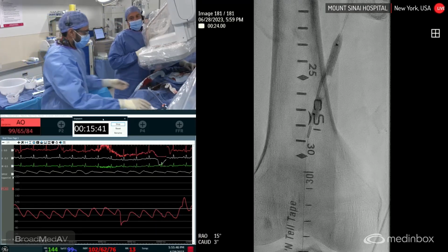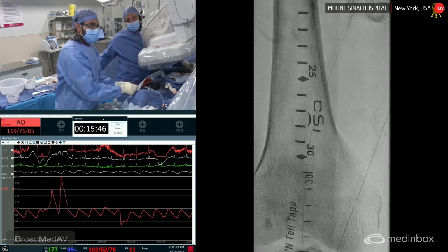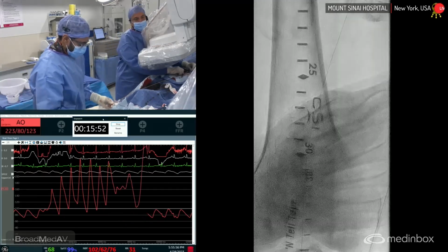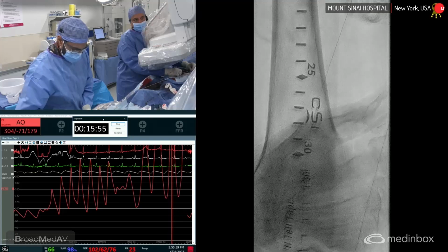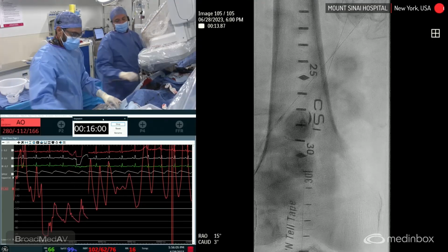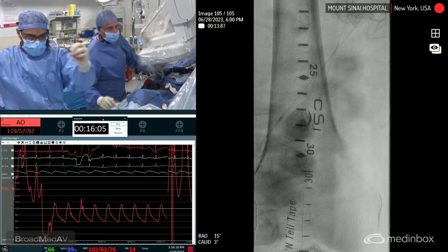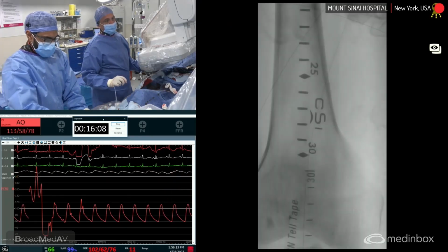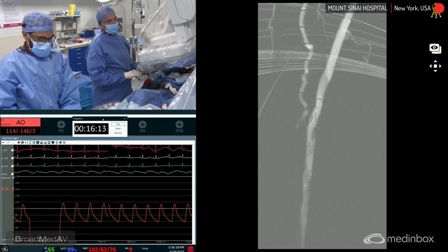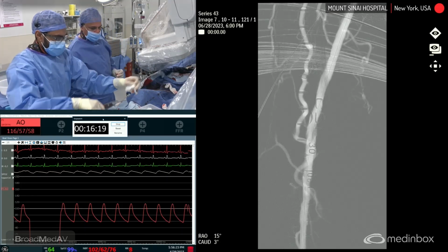Get the Supera ready, please. Yes, sir. And a 5.56. That's fine. Can I take a picture first? So again, we prepped the vessel for Supera. Let's go ahead and do a quick roadmap, like you said. So flush the Supera always, both lumens, and then wipe the Supera down nicely. See, there you go. So all the way across 30, we're gonna go ahead and Supera it. Always want to wipe the lumen down.